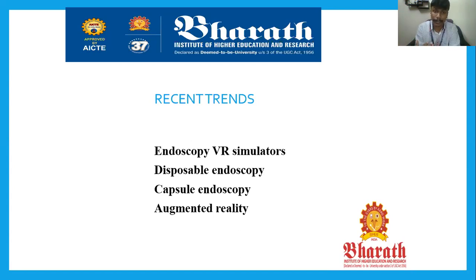With the endoscopy VR simulator, doctors who are being trained are given endoscopy practice via simulators, which come under artificial intelligence applications. They learn properly how to handle the patient without having a first try directly on a patient. After training, they come for real-time endoscopy that will not affect the patient.